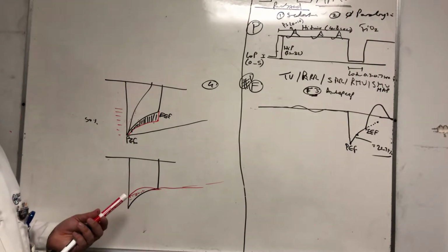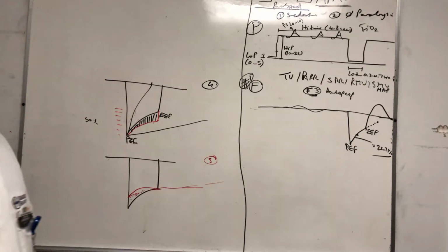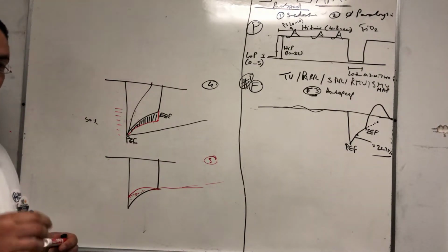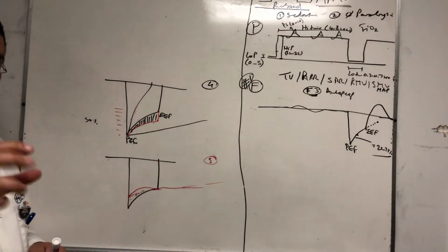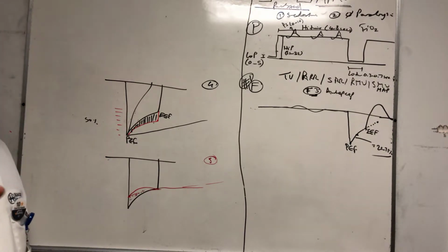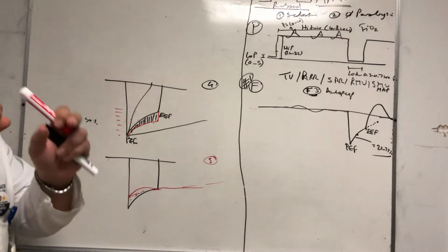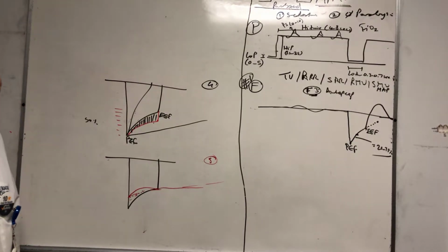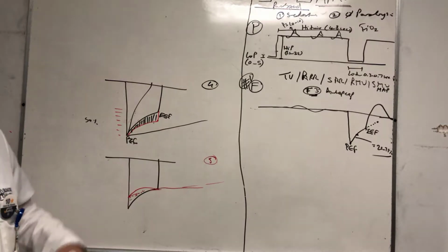This is very rare. You know why it's very rare? Another claim to fame to this mode. I have never, ever seen bronchoconstriction, right? Bronchospasm during APRV, classic APRV. You don't see it. Why? You remember when we talked about the PEEP is a way to actually treat bronchospasm? Mechanically, the muscles around the bronchus want to contract, but you're just tenting them open with the pressure inside. You can contract whatever you want, but you won't be able to close the airway.